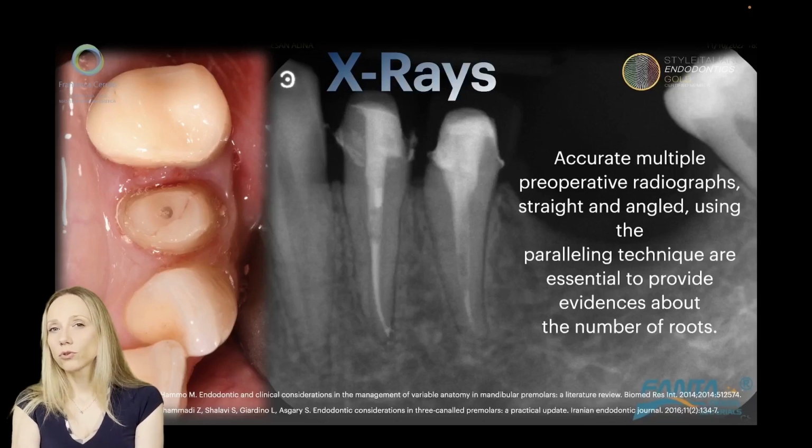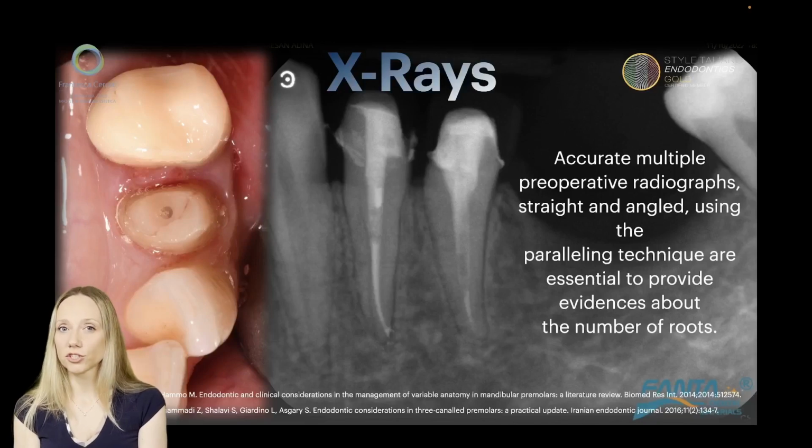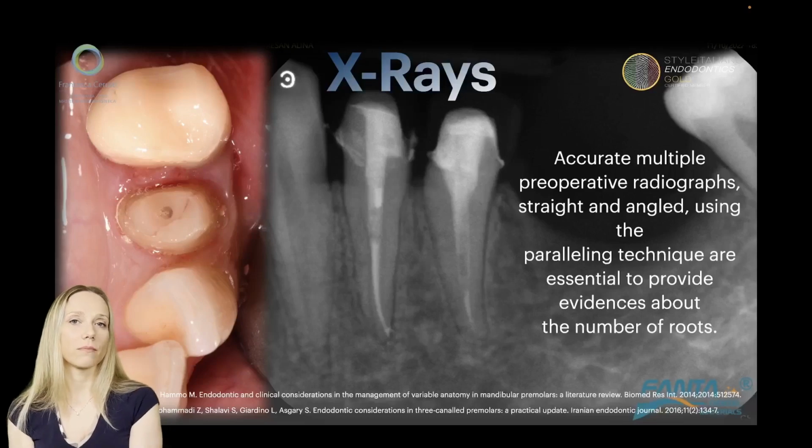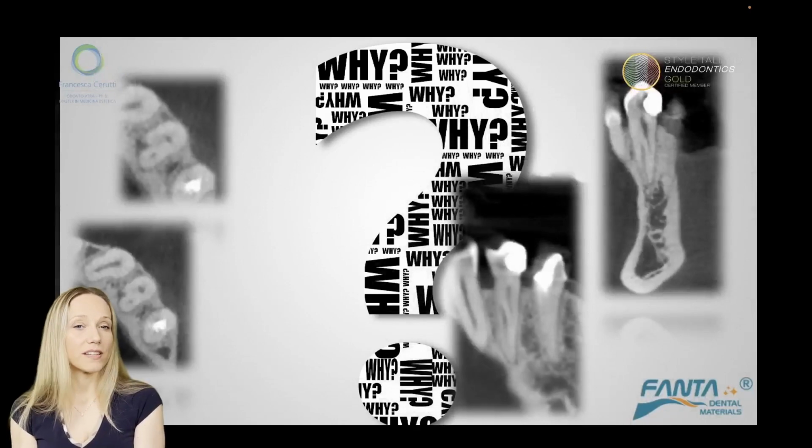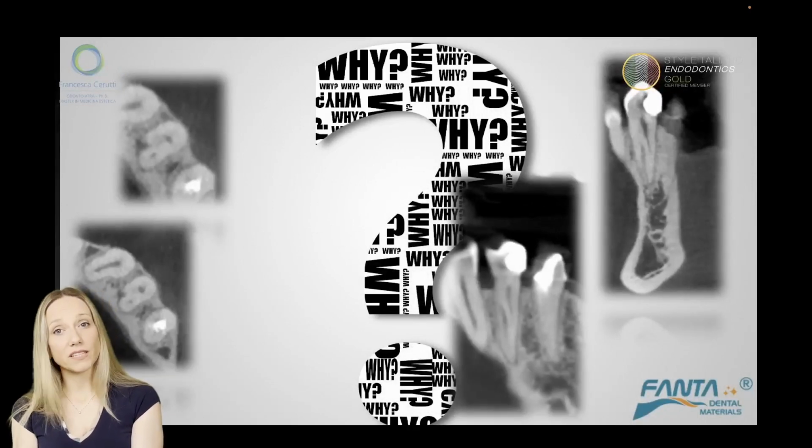Then the pain to cold slightly disappeared, but she still had a lot of pain when I saw her. And I asked my colleague, since there was a missing tooth nearby, did you take a CBCT for placing an implant? He said, yes. So please send it to me.